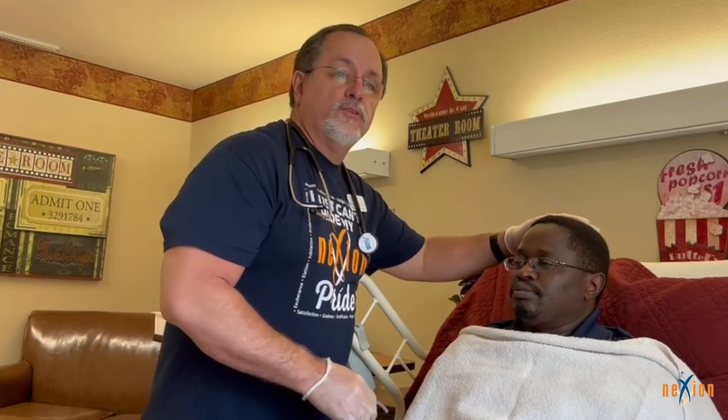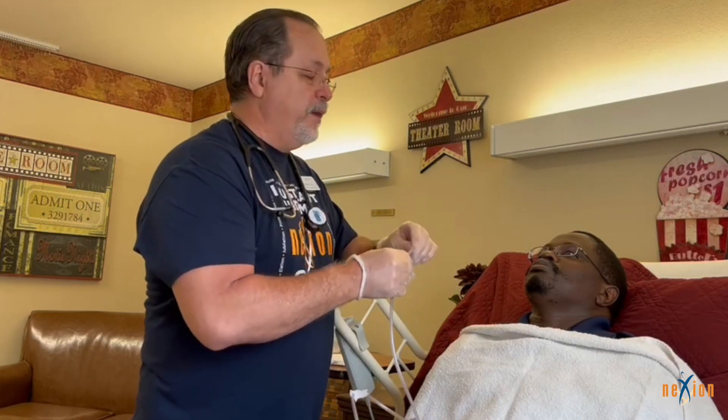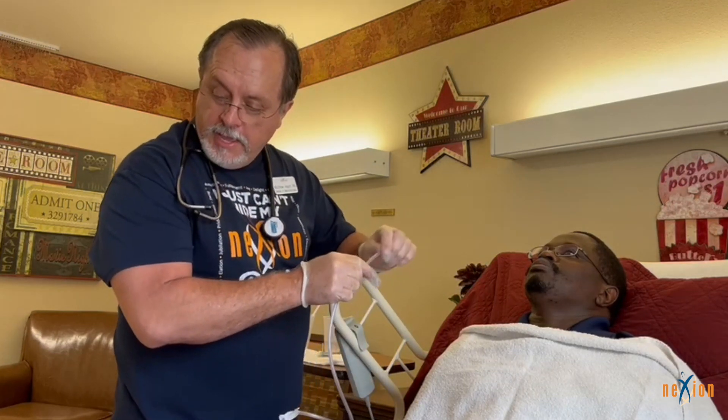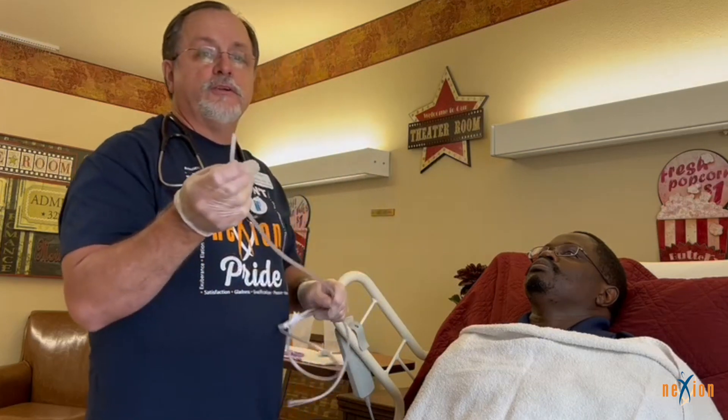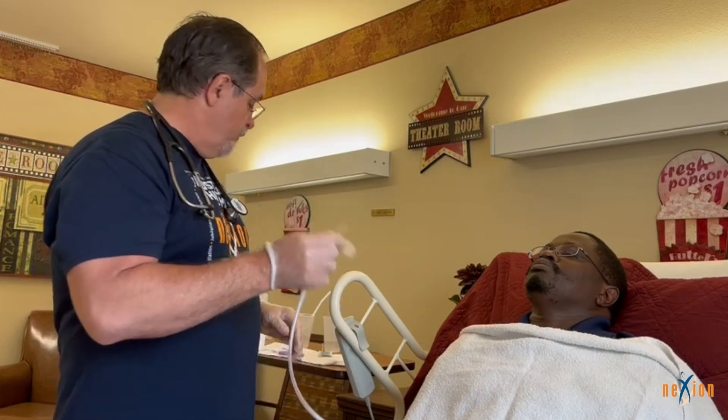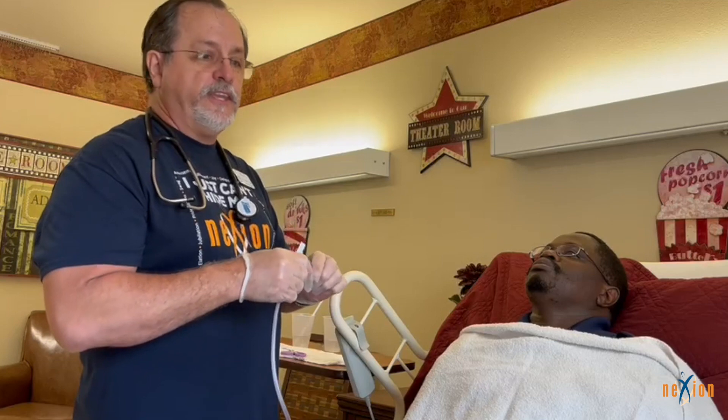Tilt the resident's head back and examine the nares to make sure there is no blockage. If there is blockage in one nare, choose whichever one is the clearest. Then check whether it is a self-lubricating tube. If it is not self-lubricating, apply lubricant to the end of the NG tube.